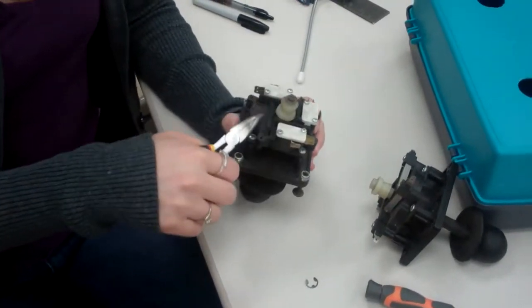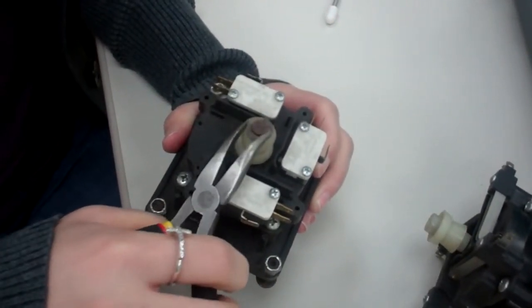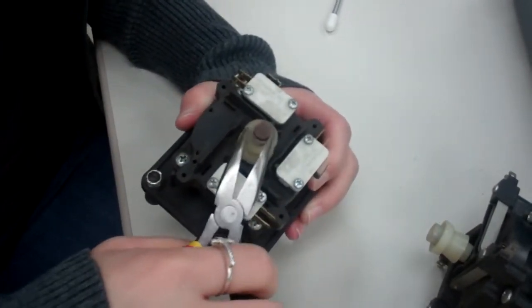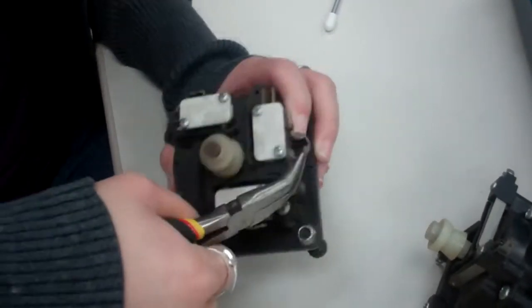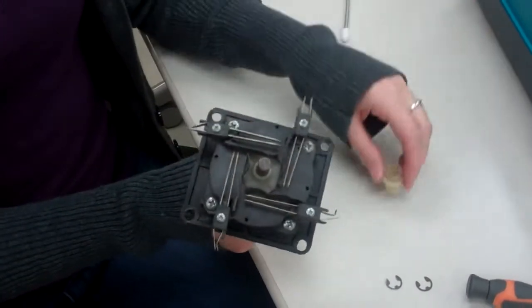Now we're going to take this C-clamp off in order to put it inside of this hole. What you want to do is push on this side and then push in the opposite direction. After taking the C-clamp off, you'll be able to disassemble it.